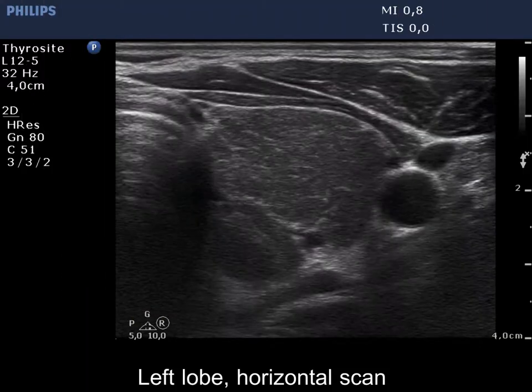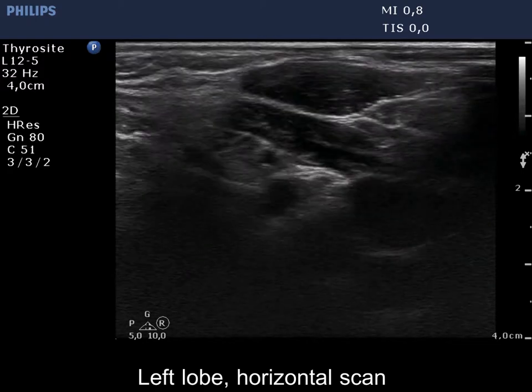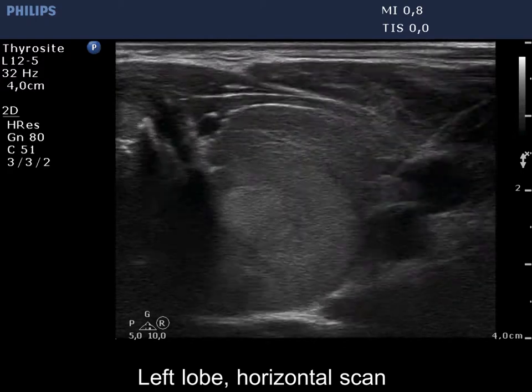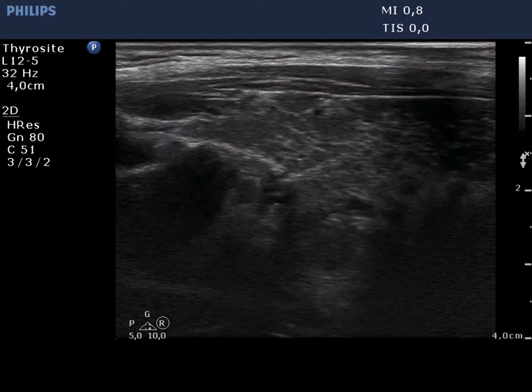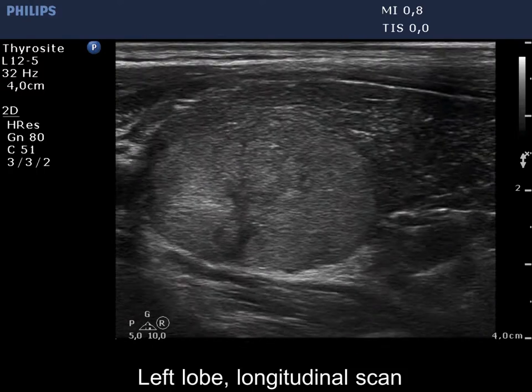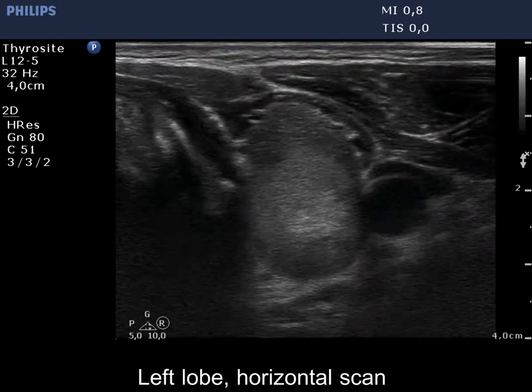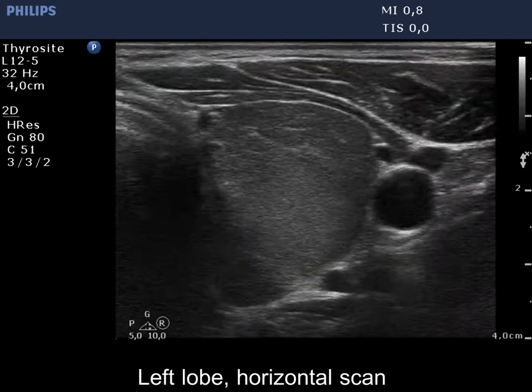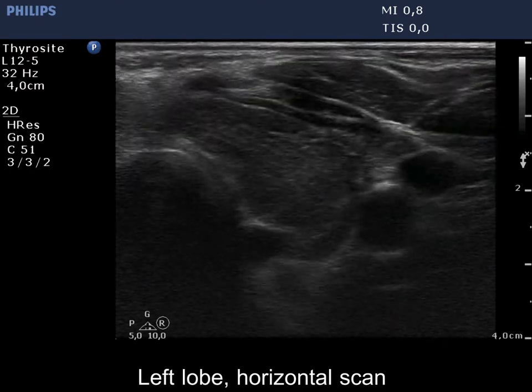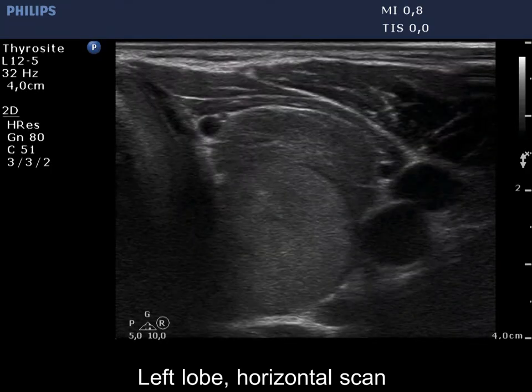The thyroid is moderately hypoechogenic and inhomogeneous, corresponding to the underlying thyroiditis. There is an isoechoic nodule in its dorsal part. The contour is abutting and the capsule is invisible in the medial part of the nodule. The nodule shows a taller-than-wide shape.